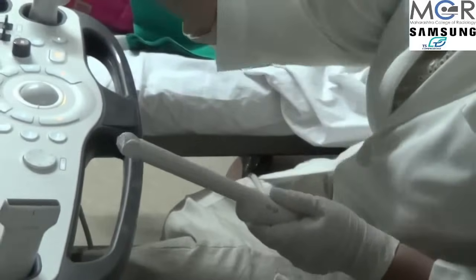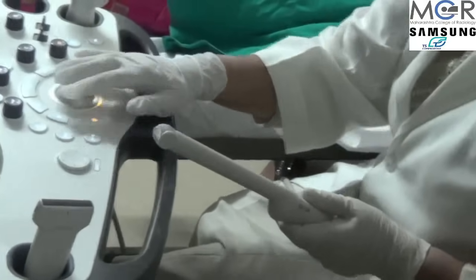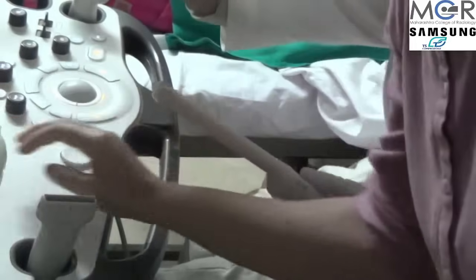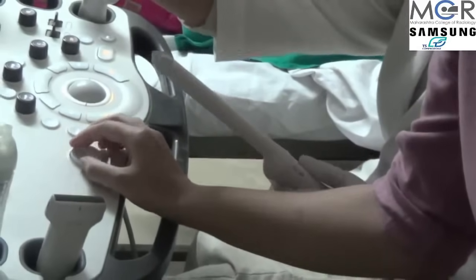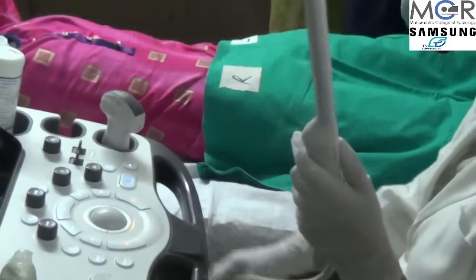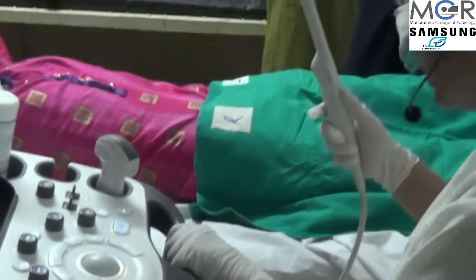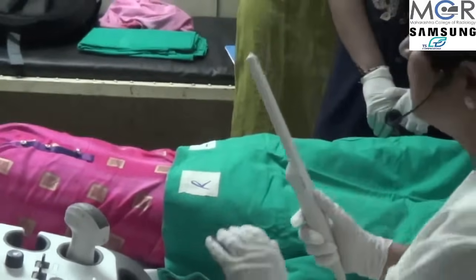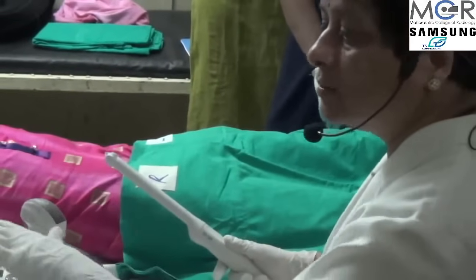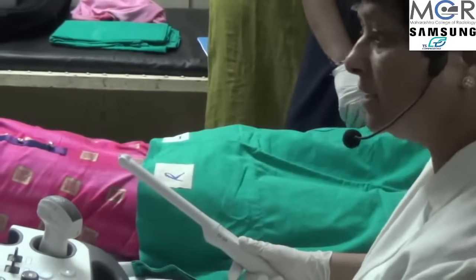Before we start the examination, we put our presets on the gynec preset — adnexia. We have put the machine on gynec setup. It helps if we are in the right presets because all this monitoring is done by the company. Nowadays, we have very good machines.